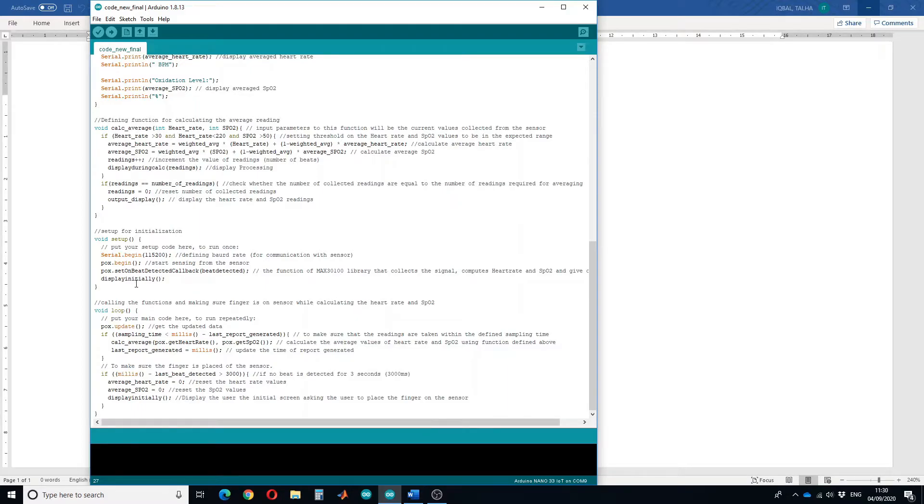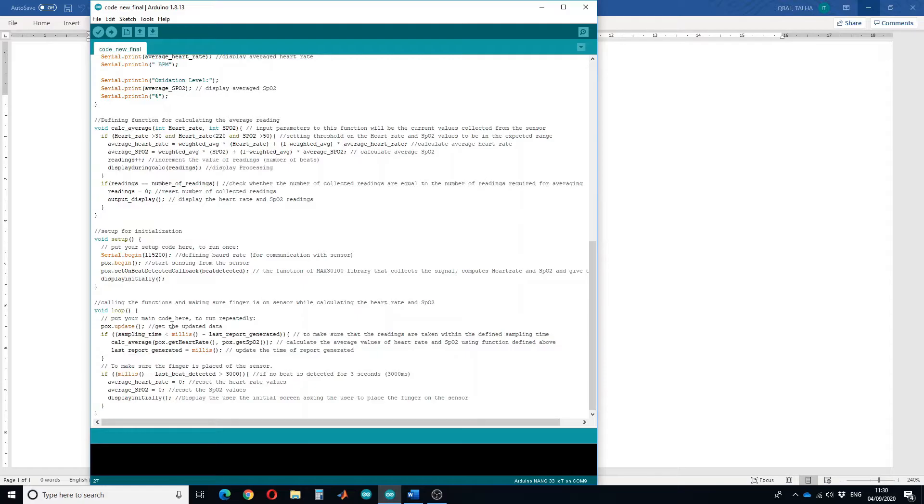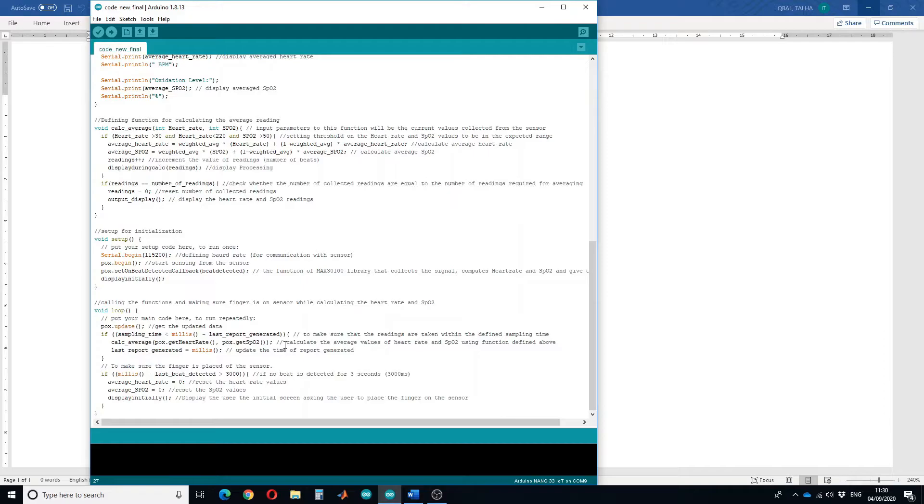In the loop we will ask the sensor to get updated data. This line of code is to make sure that the readings are taken within the defined sampling rate, and then we call the calculate average function. We will save the new report generated time in the last report generated variable.